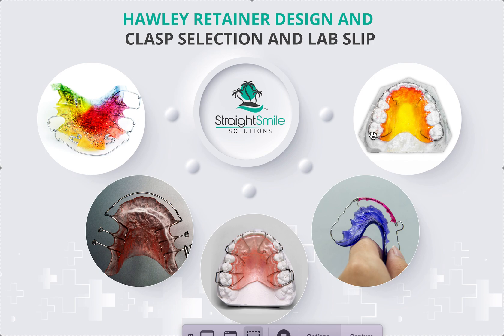My personal Hawley has no guide wire so nothing goes over the occlusal table — I cut mine off because I don't like anything blocking me from biting down, which can also cause weird things to happen with your bite. Most commonly, circumferential retainers do come with a guide wire. I also love what they did to this circumferential — also called a wrap-around — by putting acrylic on the labial bow. That's smart: it really helps to keep teeth straight, almost like an aligner, but again — only ins and outs, not vertical.